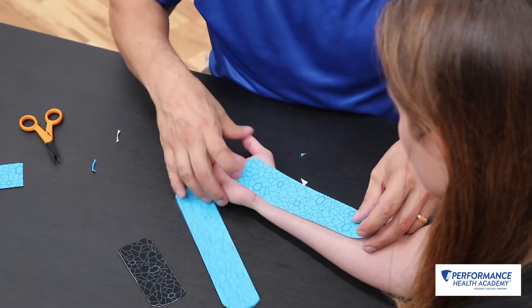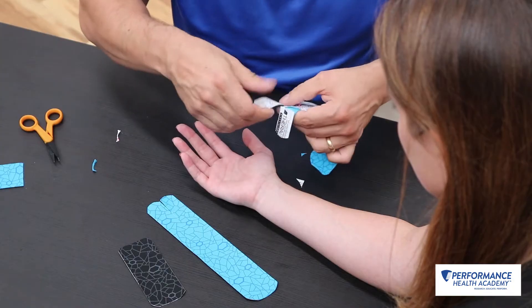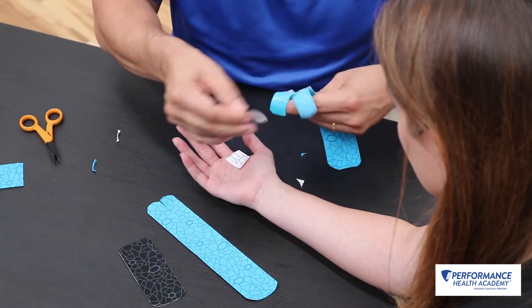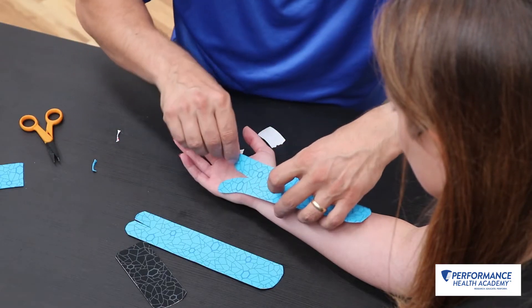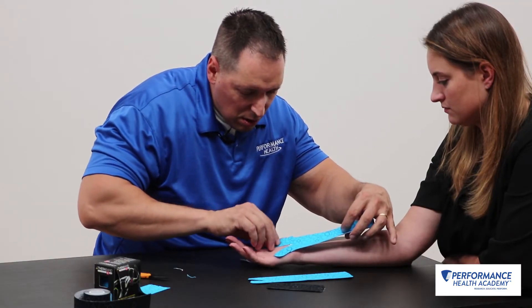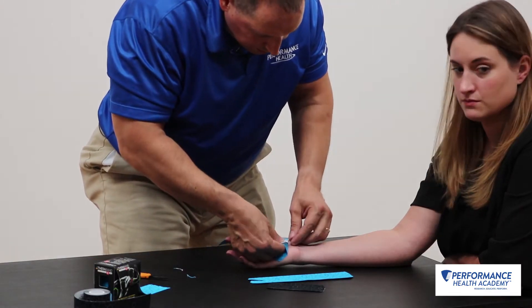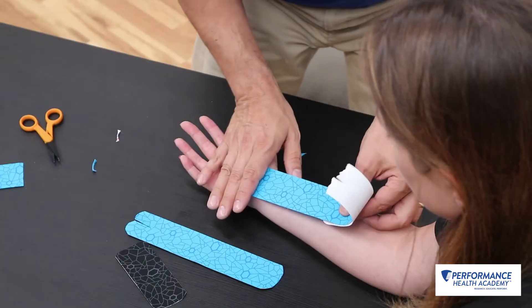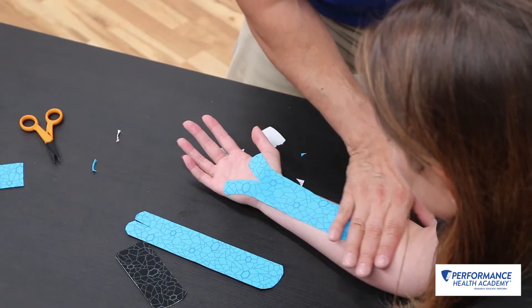Place the wrist in neutral. I'll go ahead and break my edges here and lay them down on the thenar and hypothenar eminence. I'll flip that tape back, then apply about 25 to 50 percent tension along the course of the median nerve through the forearm.